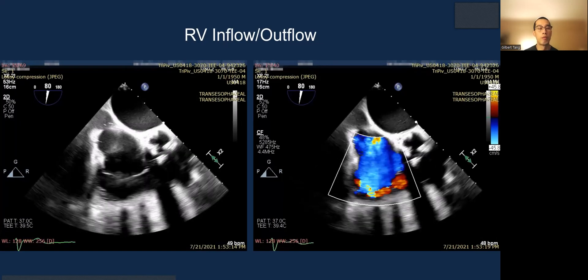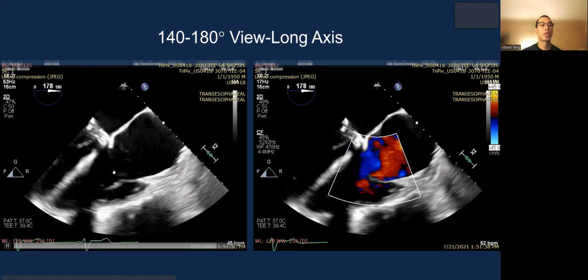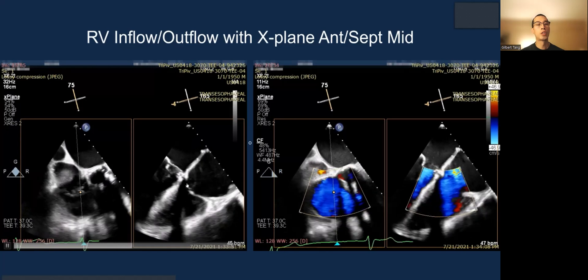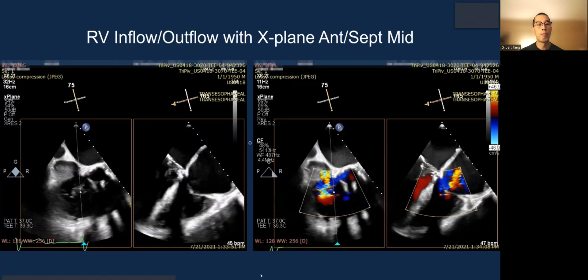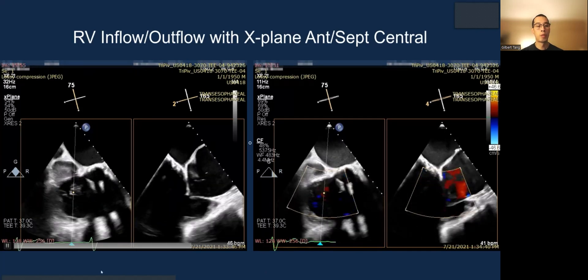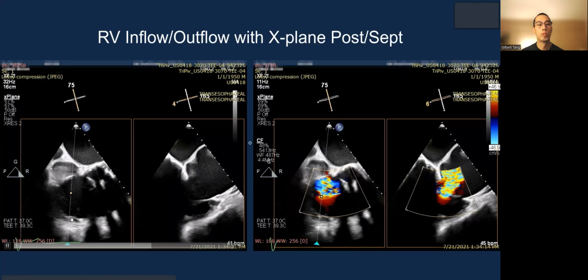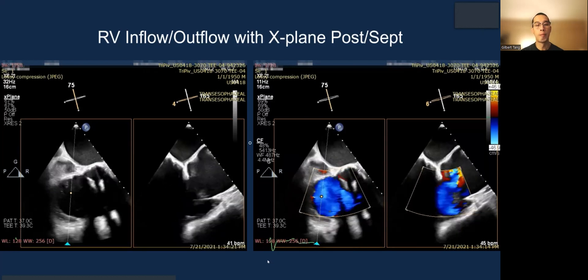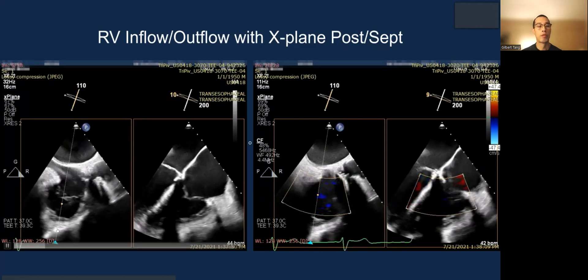This is the RV inflow view, a standard view without X-plane. This is the 140–180 degree reverse four-chamber view looking at the area you will likely be grasping. The key working view is the RV inflow-outflow X-plane showing anterior septal at mid area — now more central in the middle — and then posterior septal by moving the cursor from the aortic valve side toward the lateral wall side.